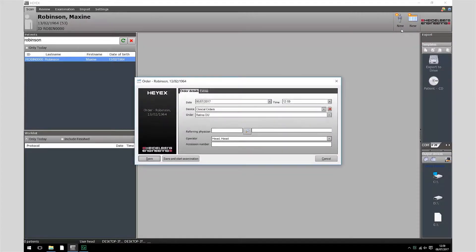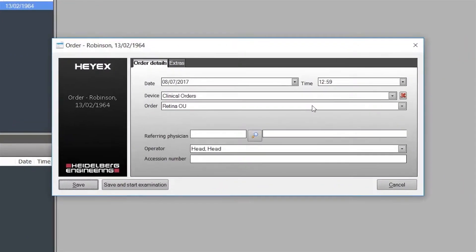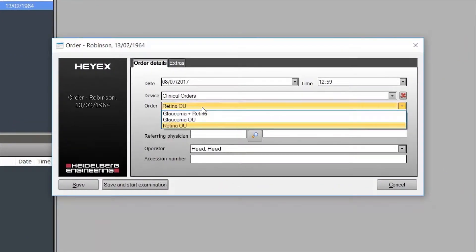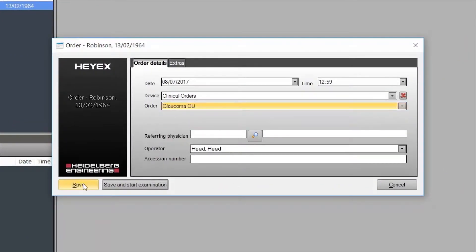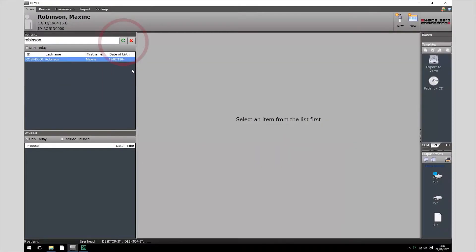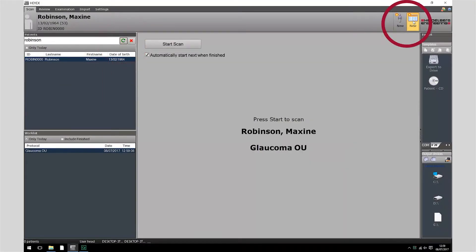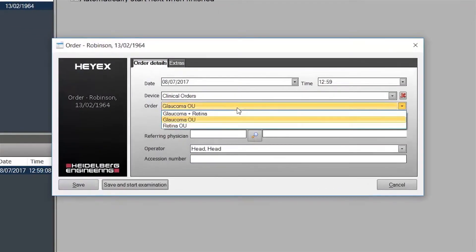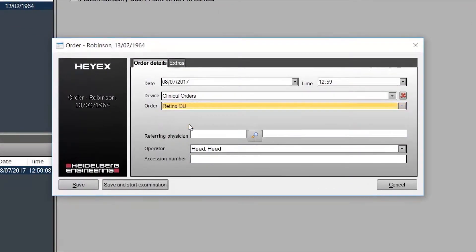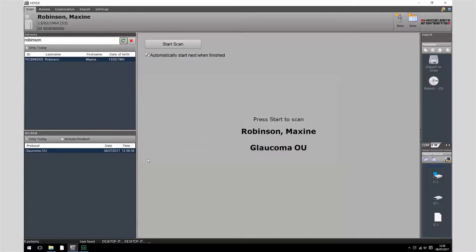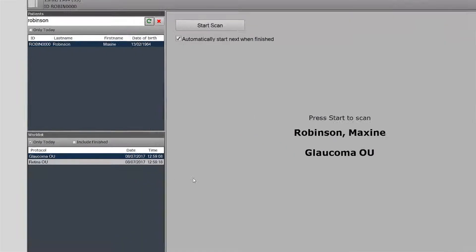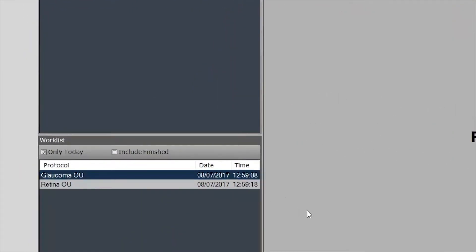Select the order tab and choose the Glaucoma OU work order, then click save. Click the refresh button and then select the Retina OU work order, save and refresh the window. Ensure that the Glaucoma work order is highlighted before starting image acquisition.